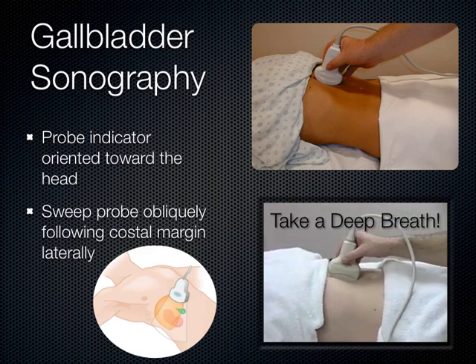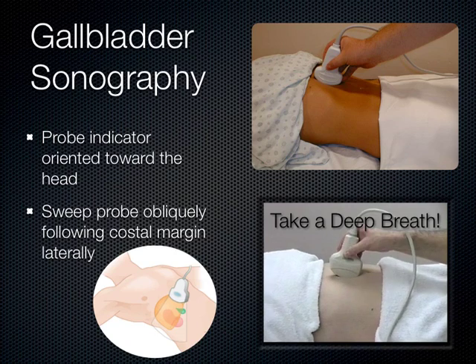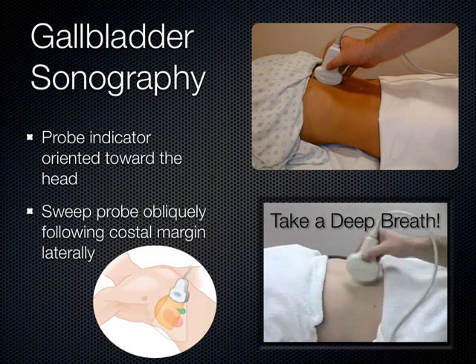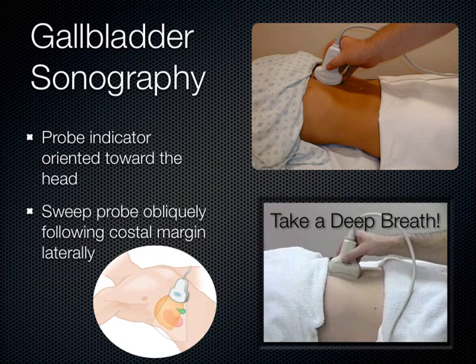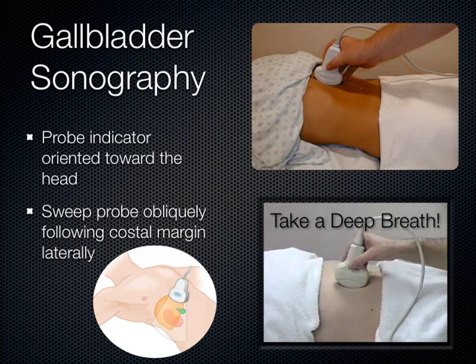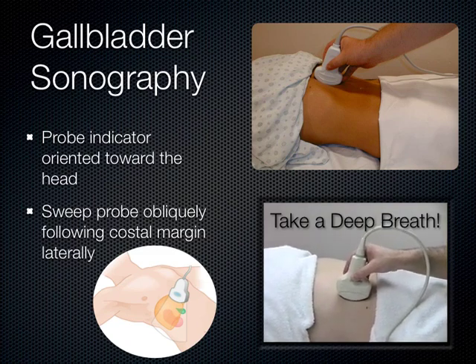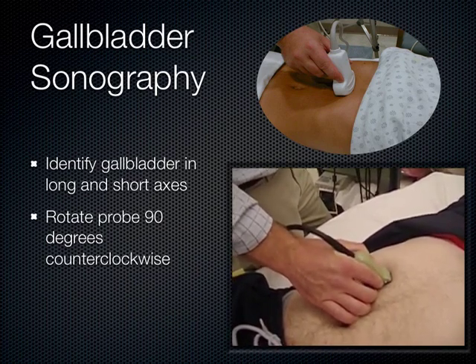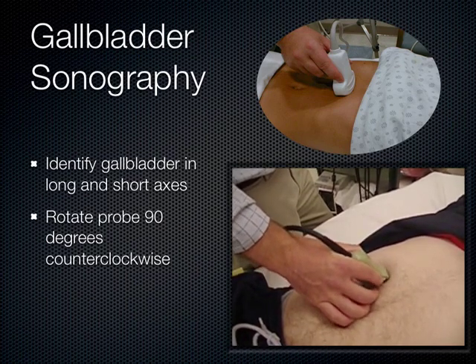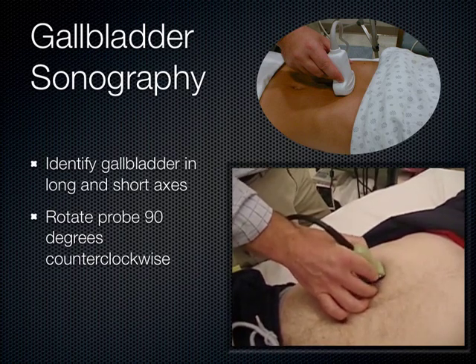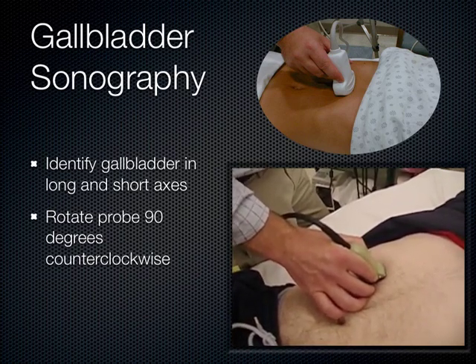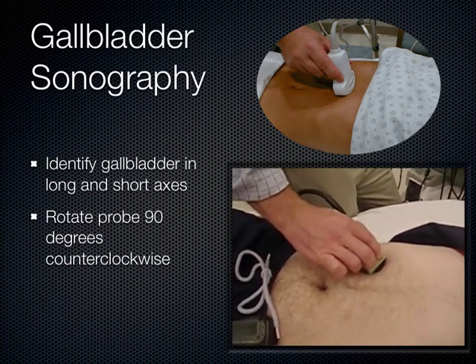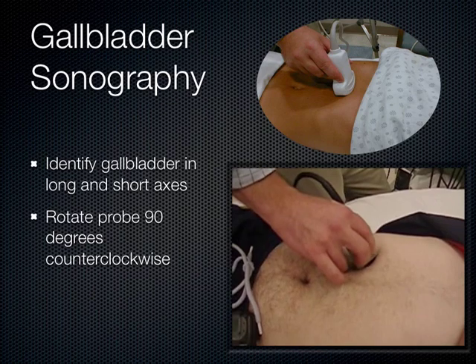Switching to the gallbladder. Place the indicator towards the patient's head in a sagittal plane — the patient takes a deep breath — that's the subcostal sweep. Once you get the gallbladder in its long axis, rotate the probe 90 degrees to get the short axis. Fan through the entirety of the gallbladder in both axes looking for any type of pathology.